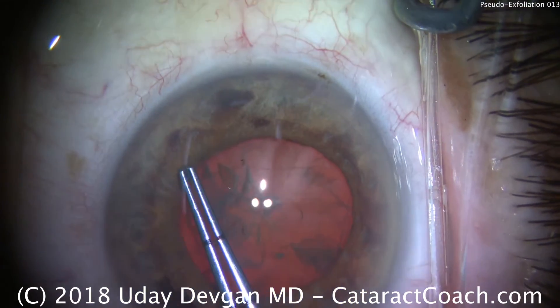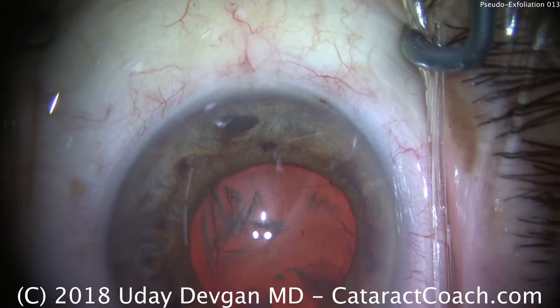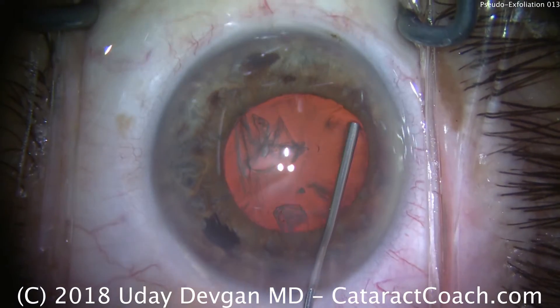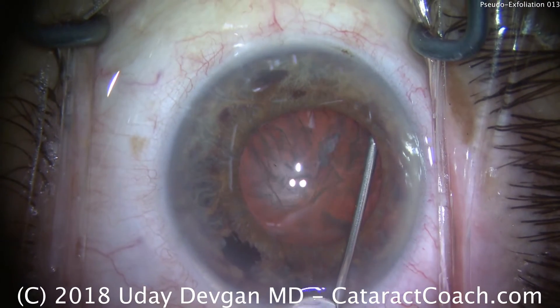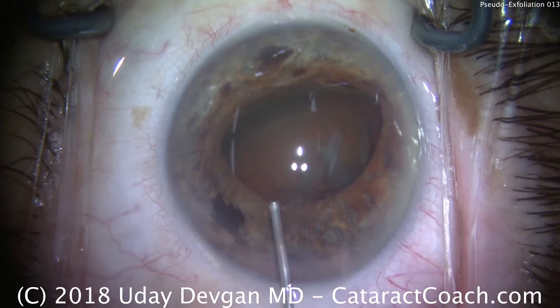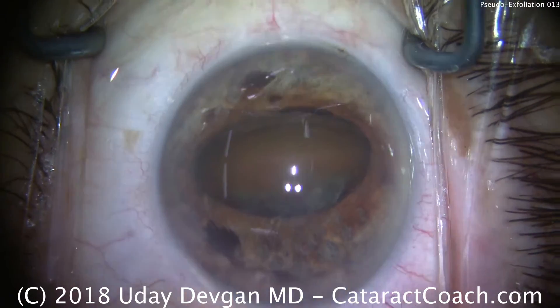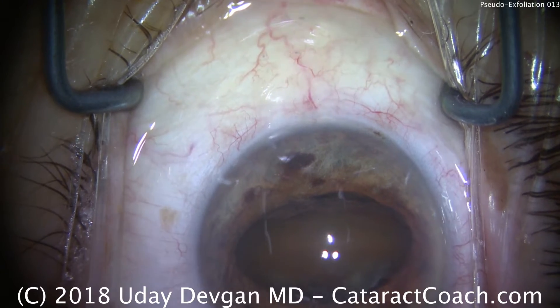We're going to make the round rhexis here. Some of it does go under the iris — that's okay, we know where that is. When we do our hydrodissection, I want to bring the nucleus out of the capsular bag. There's the fluid wave going across, there's the nucleus being prolapsed, and that will help dial the nucleus up, at least partially captured within the pupil.